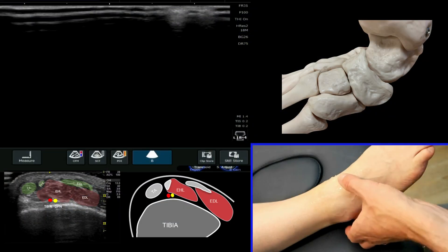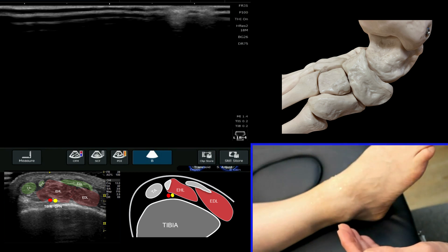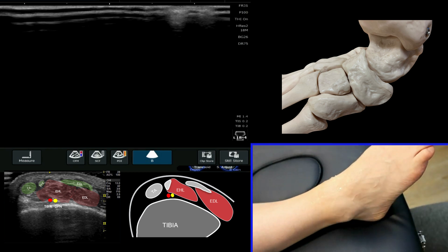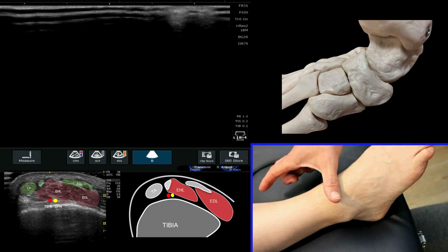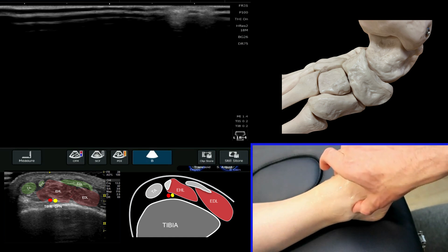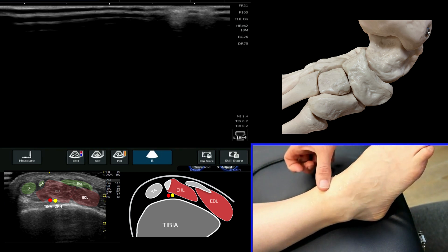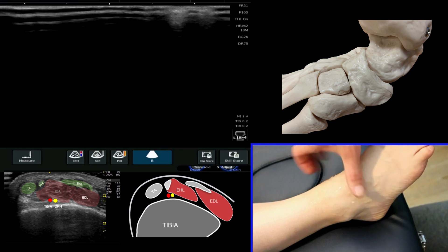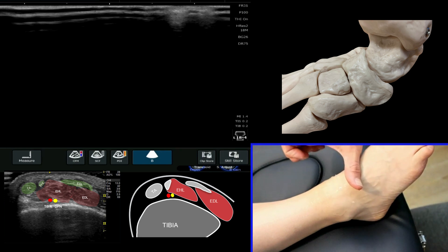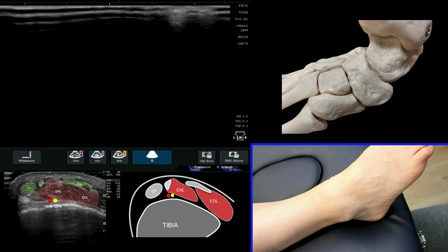We're now going to look at the anterior ankle and some of the soft tissue structures that lie across this region. Before we start, it's always useful to bear in mind that the ankle joint sits a little bit higher when you're going to palpate it. If you palpate the distal tip of the lateral malleolus and the medial malleolus, it sits a little bit higher, so don't be tempted to place your probe lower — you'll be over the midfoot region. It needs to be that little bit higher over the ankle joint itself.